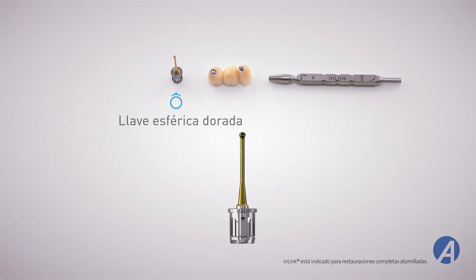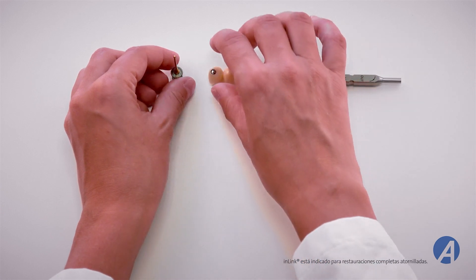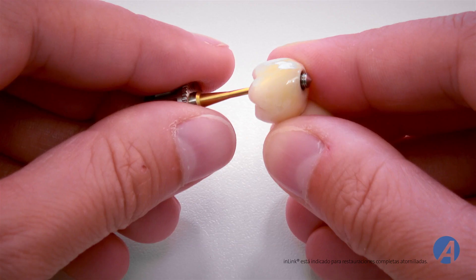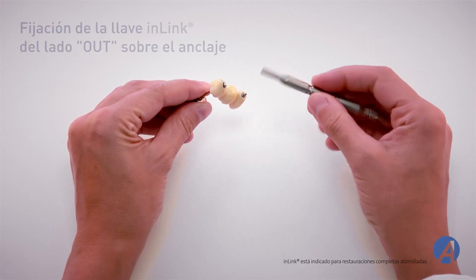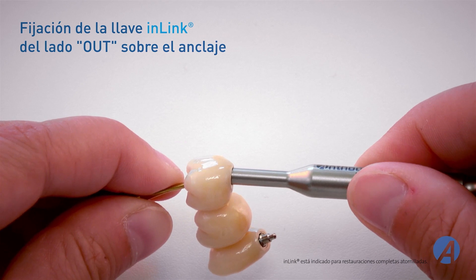La llave esférica dorada. Tome la prótesis. Coloque la llave esférica dorada en el conjunto del anclaje que desea desmontar. Sujete la llave esférica y enrosque totalmente la llave in-link del lado OUT sobre el anclaje.